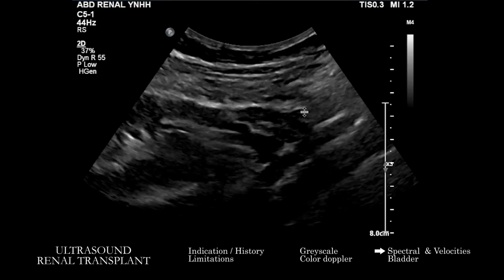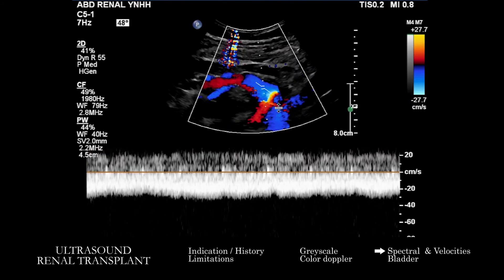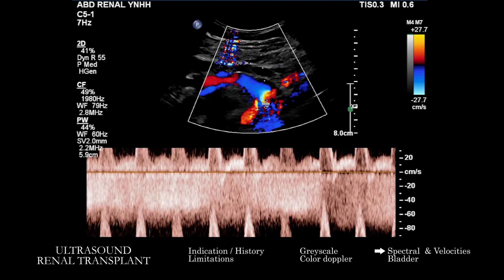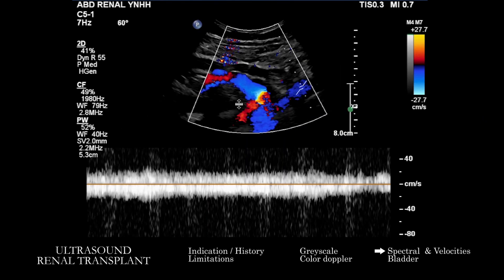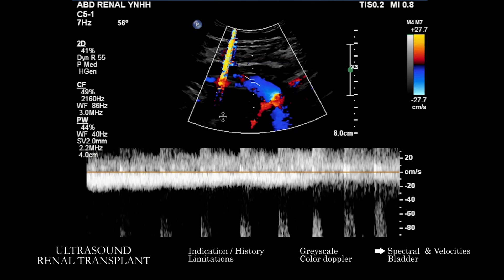Looking at the collected values, how have the resistive indices changed compared to prior? Are any of them greater than 0.8? What has been their evolution over the course since time of transplant? Those are questions you want to keep in mind. Also make sure not just the arterial anatomy is patent, but the venous anatomy is patent and has expected venous flow on the spectral Doppler images.